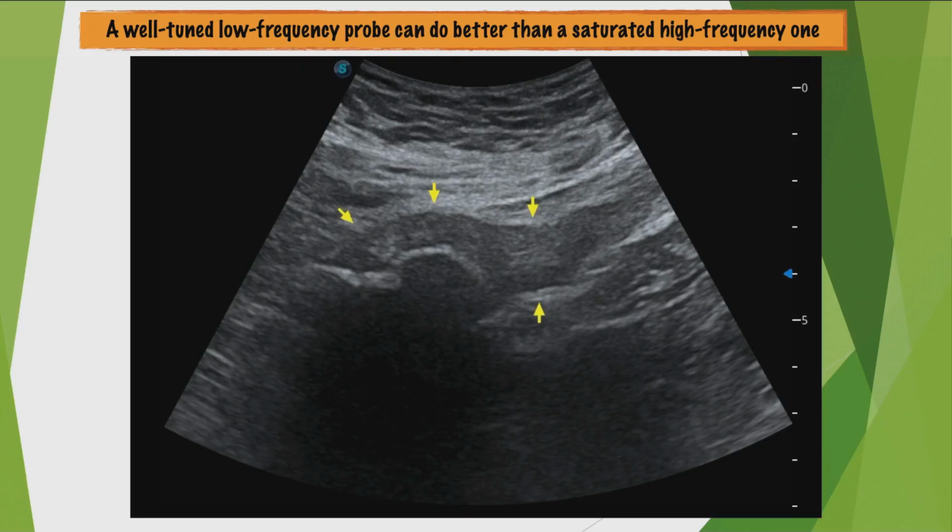You can see that by switching to the abdo probe, then obviously you increase the frequency of your abdo probe, improve contrast, manage its depth, and so on. We do a lot of things.